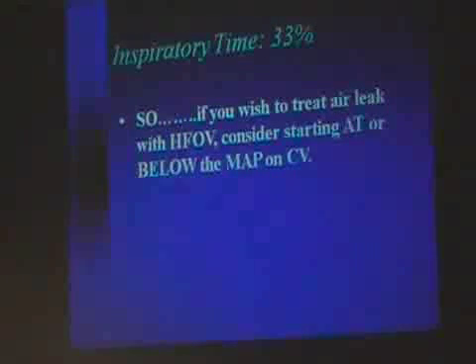I would not recommend the oscillator for air leak at this time. When you have hyperinflation, you're already hyperinflated, your problem is oxygenation. Even when you start with the low MAP, it may not help. Right? It may not. I just wanted to apply the bedside application as we are in the classroom so that we all understand a little bit better. Yes, it can, and if you do choose, maybe the jets are both broken or whatever. Does the low MAP help here?